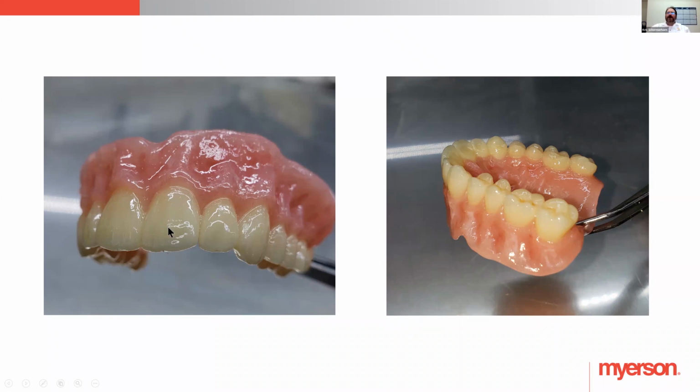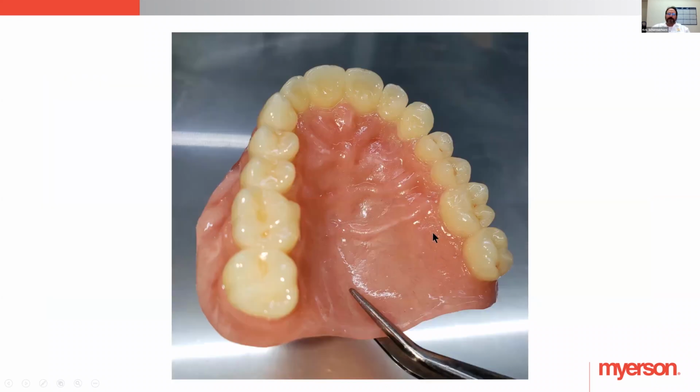And once you paint on your OptiGlaze and then you move to your clear coat, less is more. You could make that thing look like a marble, as shiny and as smooth as a marble. That's not the way natural things are. So a nice thin coat, really brush it out and spread it out so you don't get a little puddling and a super shiny surface. You just get a nice shine to it.